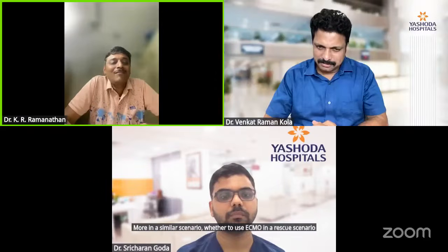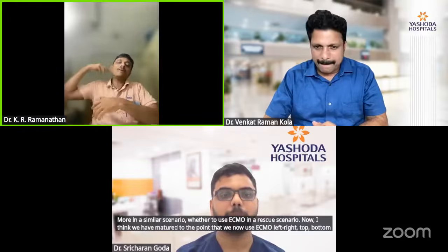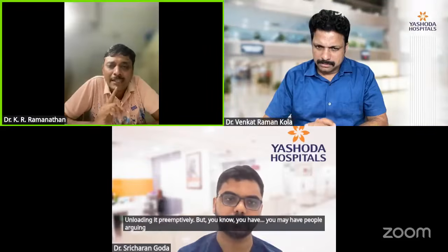Now I think we have matured to the point that we now use ECMO left, right, top, bottom. And now we're talking about the next stage, unloading the LV in a rescue pattern or unloading it preemptively. Clearly, I believe in unloading it preemptively. But you may have people arguing against it as well.